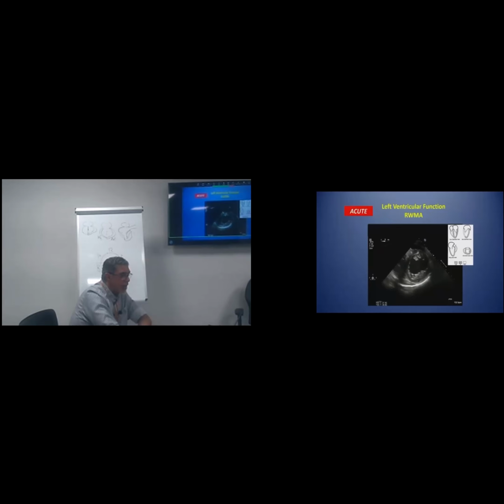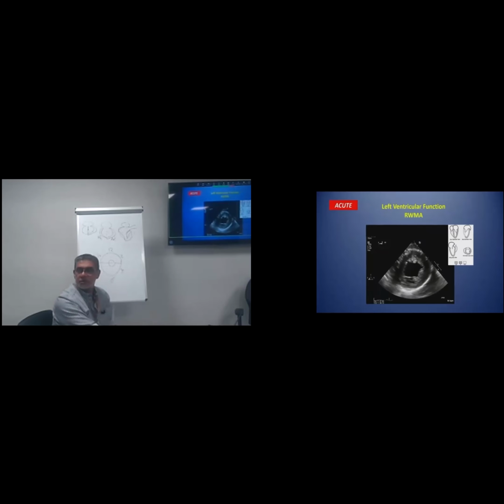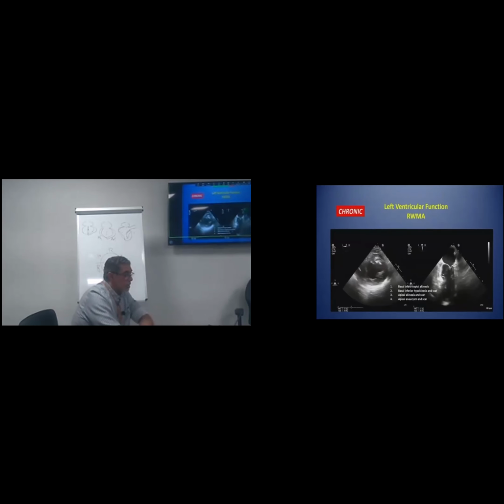Akinesia. We are repeating now. This is difficult, yes.